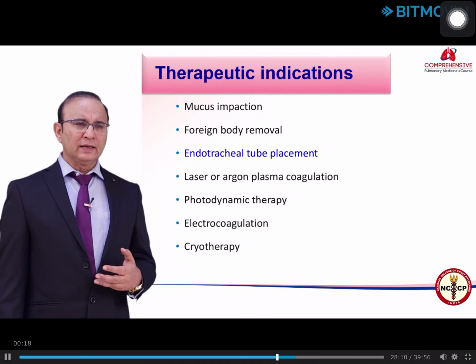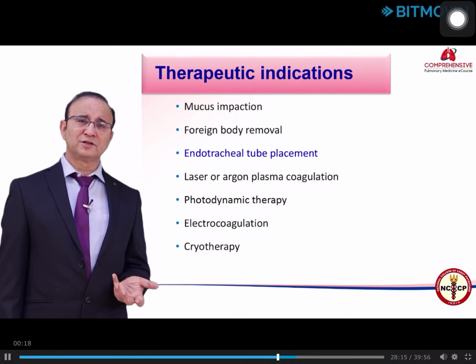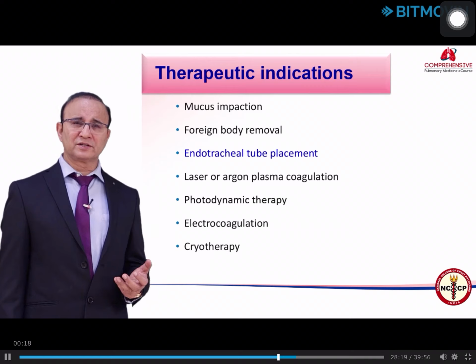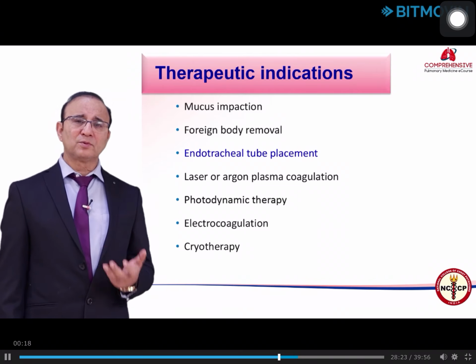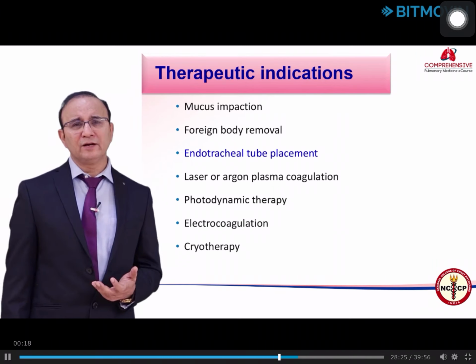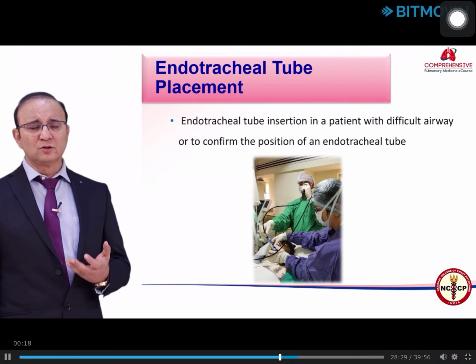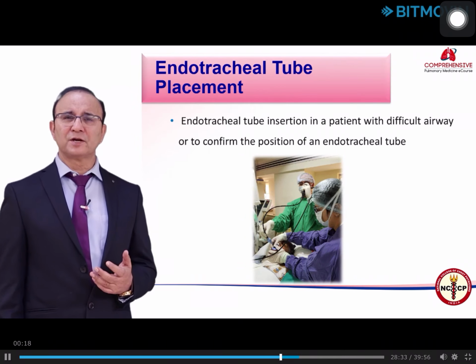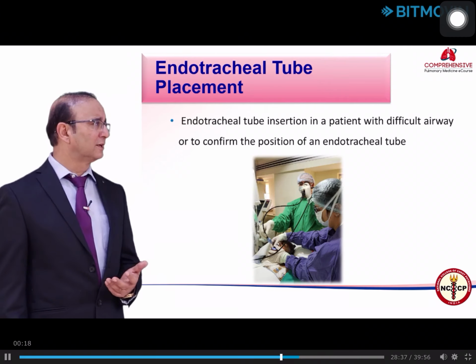In the ICU, many times a patient has a condition like morbid obesity, a short neck, or a difficult intubation. The fiber bronchoscopy could be a very useful modality, as you can see, to safely intubate the airways in these patients who develop respiratory failure or for any other indication.